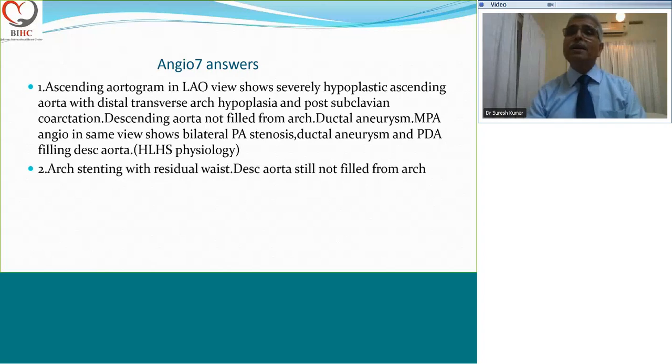10 seconds. So, no forward flow in the ascending aorta. So how does it grow? By stenting. Look, you haven't seen an LV angiogram to say that there is no forward flow in the ascending aorta. You have only seen the hypoplastic part and this, no? So stenting the arch and relieving the obstruction is some form of palliation. If it improves, well and good. Otherwise, you haven't done any harm. As I said, in the long run, this child's aorta didn't grow. But our idea was to maintain the well-being of the child, relative well-being, for a longer time.